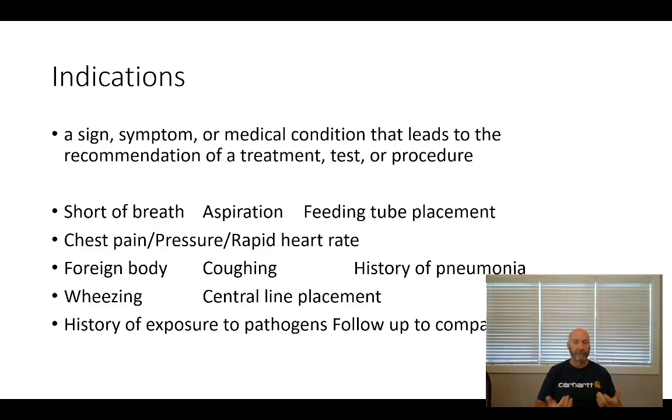So the indications for chest x-ray are going to be a sign, a symptom, or a medical condition that leads to the recommendation of a treatment, test, or procedure. So an indication is a reason that we do a particular exam, and there are a lot of different reasons, and within each one of those reasons there may be a sub-reason. So short of breath could be caused by a number of different things.